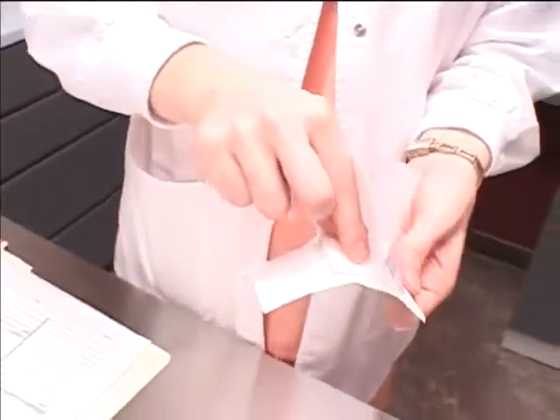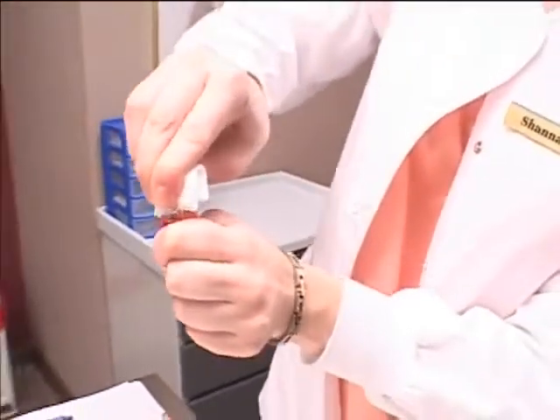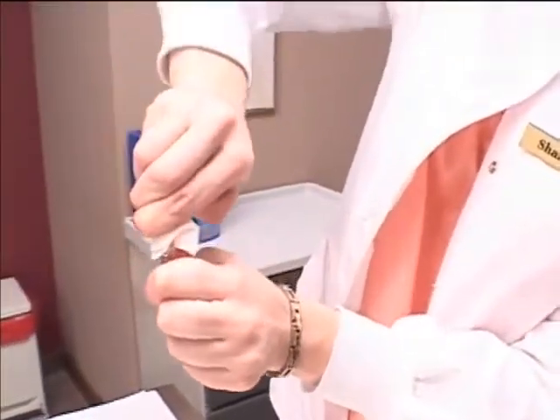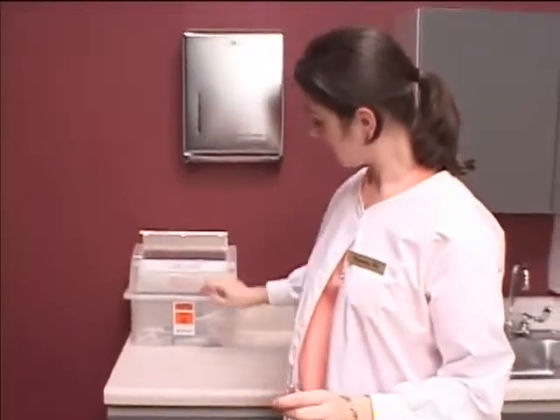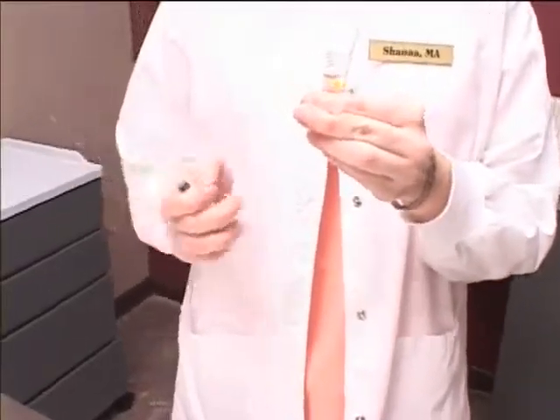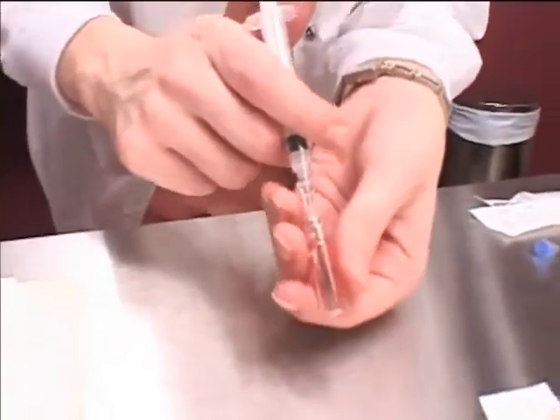Remove the sterile gauze, touching only one side, and wrap it around the neck of the ampule and snap off the top at the neck in an outward motion. Dispose of the top in the sharps container. Remove the needle cap and hold and tilt the ampule slightly with your non-dominant hand.